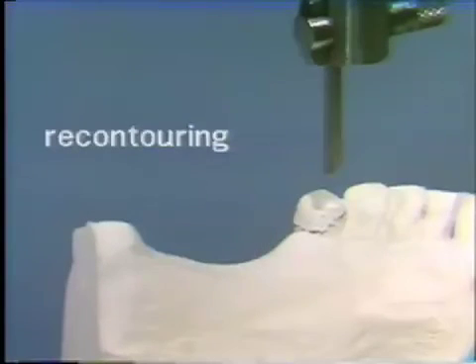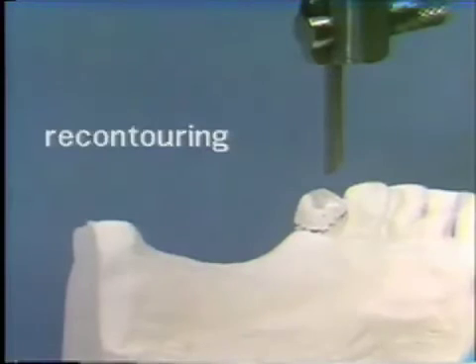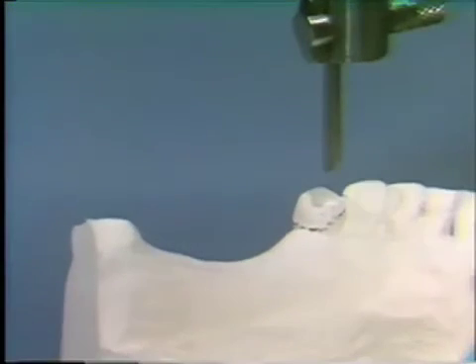All of these together go to forming the potential path of insertion and removal of the prosthesis. The surveyor may also be used to determine where and how to recontour natural teeth. This bicuspid has a high survey line on the lingual and requires a parallel guide plane. With the surveyor, we can determine where and how to produce a parallel guide plane on the lingual of this tooth, and once it is prepared, come back to the surveyor with another cast to verify the recontouring was performed exactly as desired.